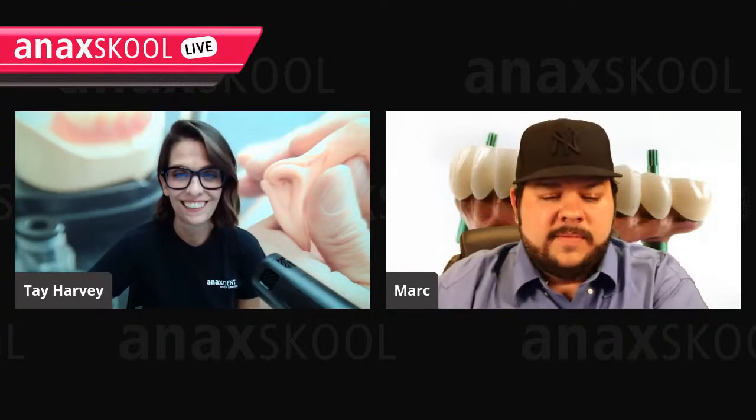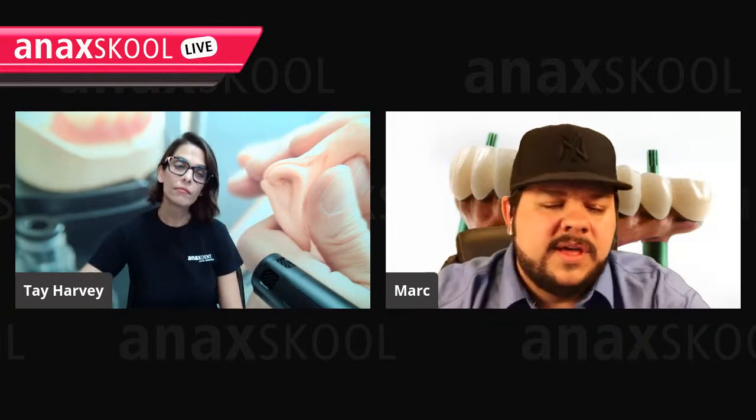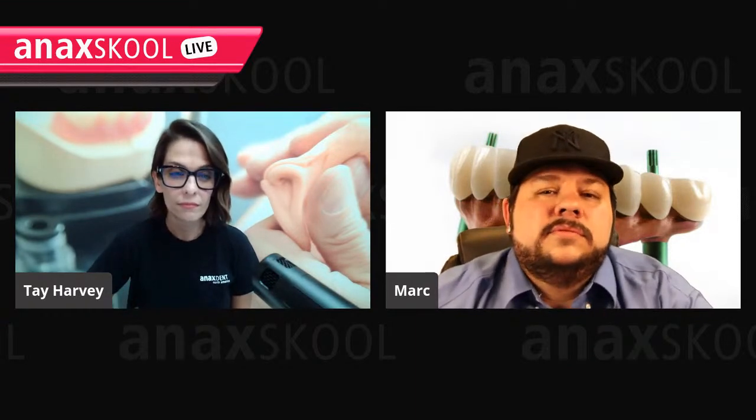Most people don't anymore. So you've got to set yourself up for these types of cases for the long run, and set yourself up for any issues that you're going to have, where you can prove that you did the best that you could do. Take pictures, take screen captures, and save each and every element on the side.